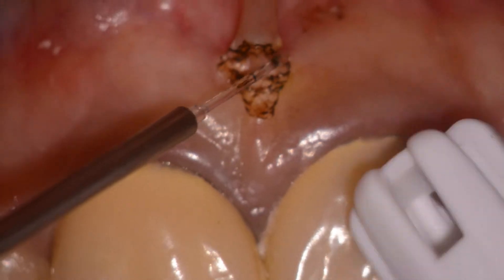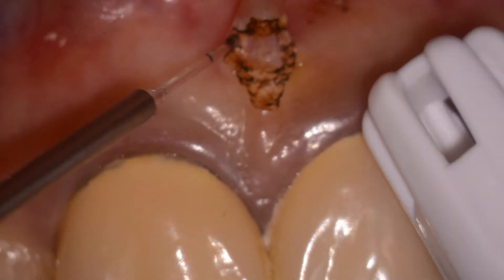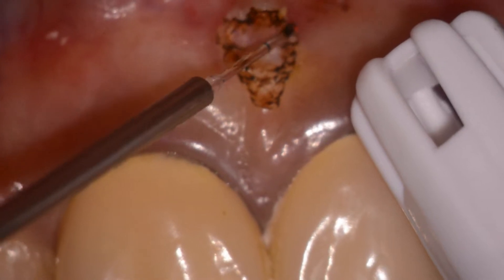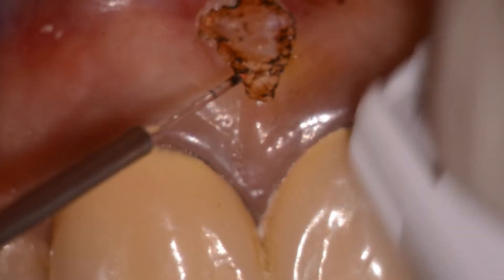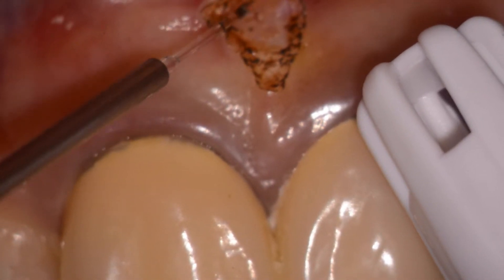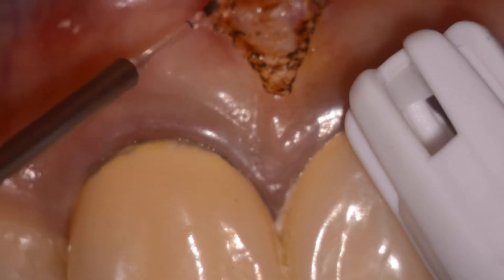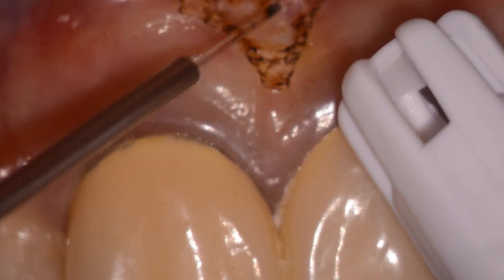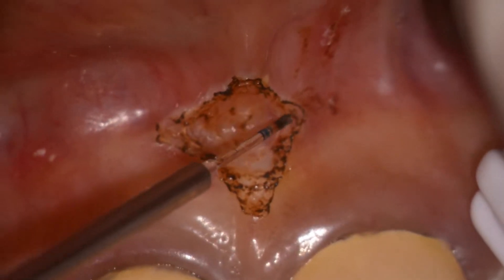We're using one watt initiated. Maybe we could use a little bit less because there's some slight charring, but you can see a very light, deft touch is all that is necessary — pulling constantly with your left hand and just touching the fibers to allow them to rupture. In a matter of 45 seconds or so, you can open up the frenectomy, as you see here, very easily and eliminate all the fibers.